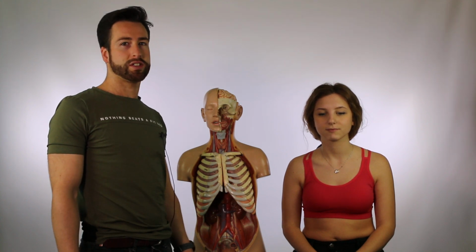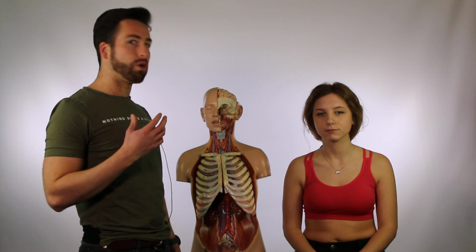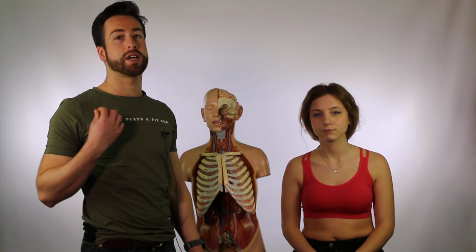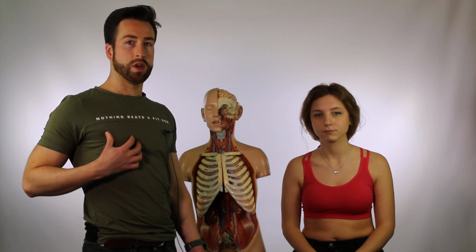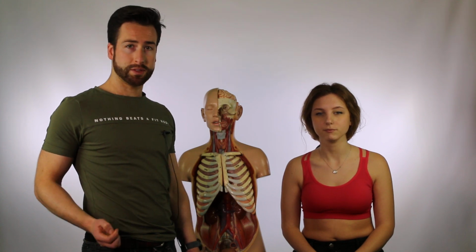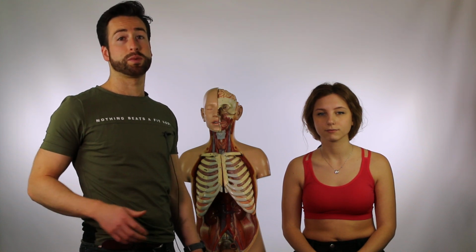So first things first, auscultation is basically, we're going to focus on auscultating of the lungs today. Auscultation is listening to the lung sounds entering and exiting the lungs. We do this in a respiratory assessment so we can identify disorders of the respiratory system.